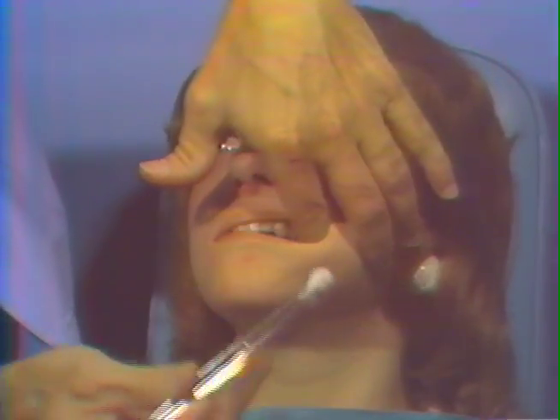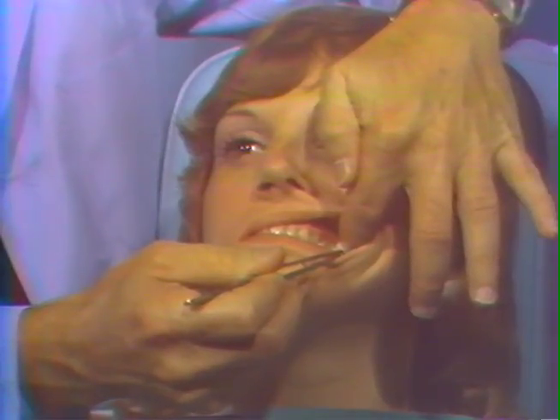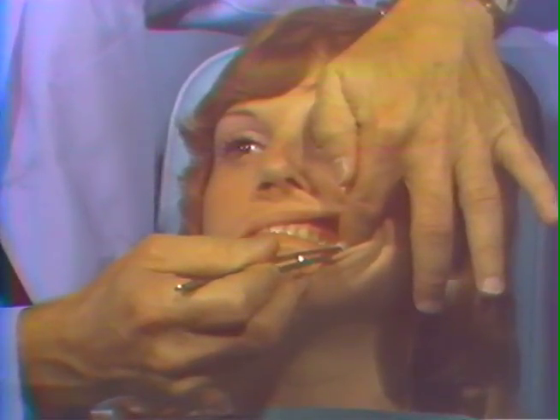Placement of the cotton roll for the topical analgesia of the left long buccal nerve. Now open once again. Let me pull your cheek. Don't let me turn your head. Open just a little wider. Now bite right down. That's it. It is now held in place with the teeth against the mucosa in the area of the long buccal nerve. Now open once again.